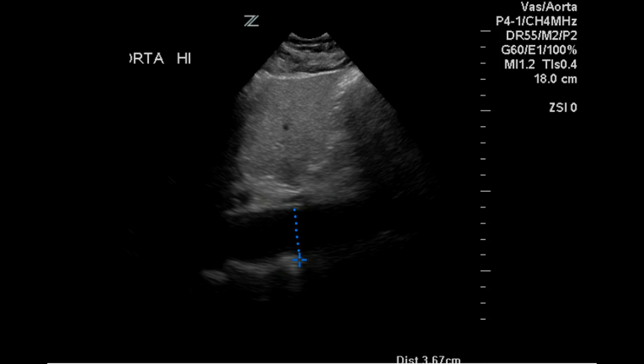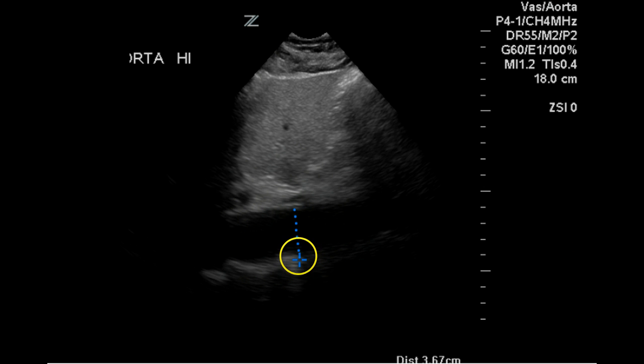This is an ultrasound examination of the abdominal aorta. This first image is a longitudinal scanning plane of the proximal aorta, and it has been measured in AP dimension. The measurement is 3.67 centimeters, which may be slightly inflated due to the misplacement of this caliper.